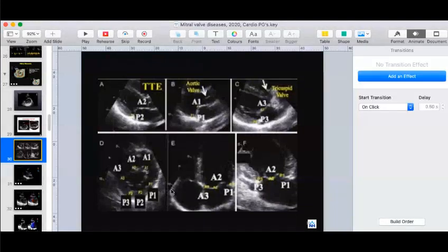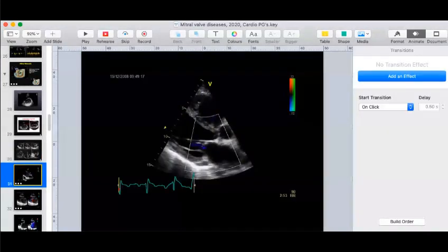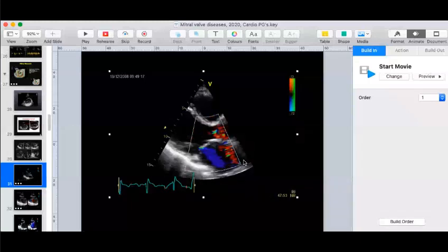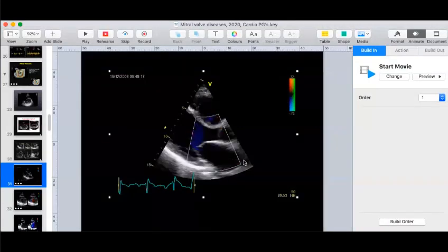Okay, so now how would you describe this MR, the direction of the flow? Is it a central MR, centrally directed? Eccentric, check. Okay, so there is some amount of eccentricity, but if I have to tell you that it is a central jet and you see a central MR, what does it tell you? Where is the mechanism? Why is that MR occurring, at what part of the mitral valve has caused this problem? A2, P2. Sir, with A2, P2.